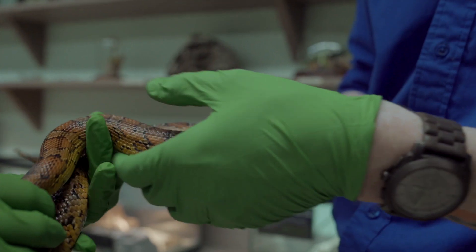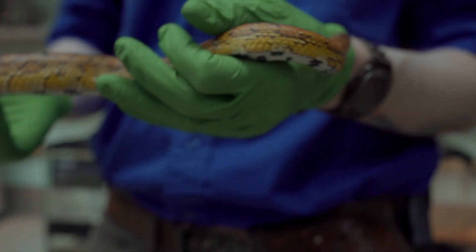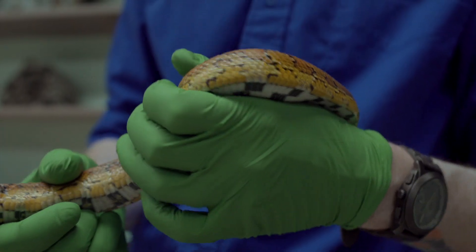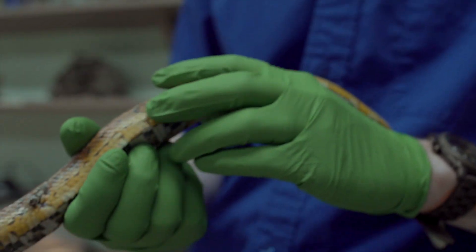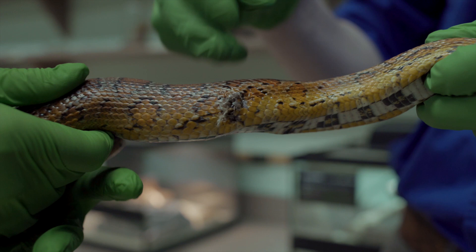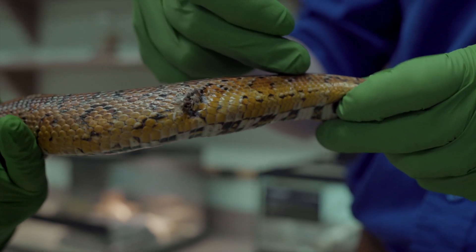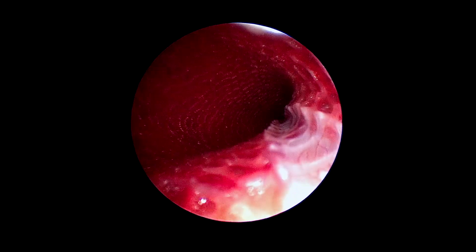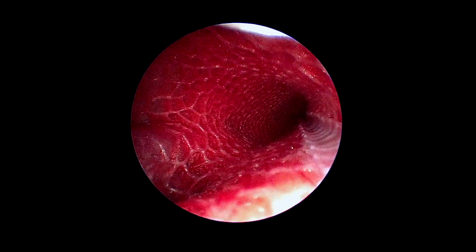A couple of weeks ago we worked on Corn Flakes. She was exhibiting some respiratory symptoms. We started on some antibiotics, but we wanted to make sure there was not an obvious fungal or bacterial infection, so we inserted a scope into her lungs back here and got some really neat images just to make sure there were no obvious parasitic, fungal, or bacterial causes, and we took some samples while we were in there.